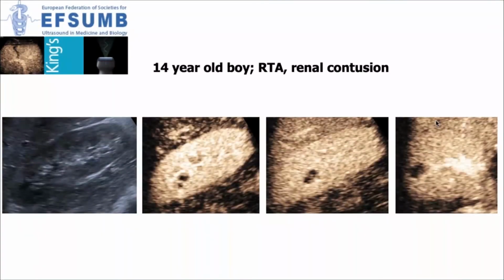And again, the small contusions. And this is where I think contrast-enhanced ultrasound really holds its own, and it reasons as to why it is in the EFSUMB guidelines. The small injuries, the child who has relatively little to find on examination, they may have perhaps a trace of blood in their urine, and actually you just need to rule out an injury. You just need to make sure there is nothing.